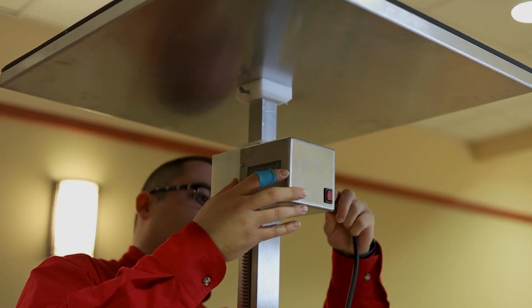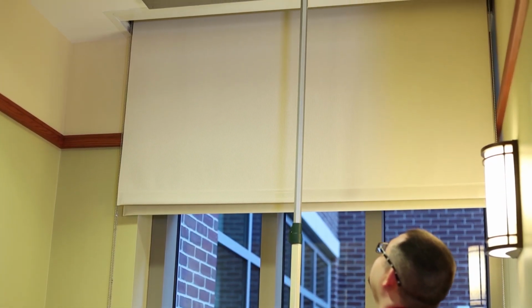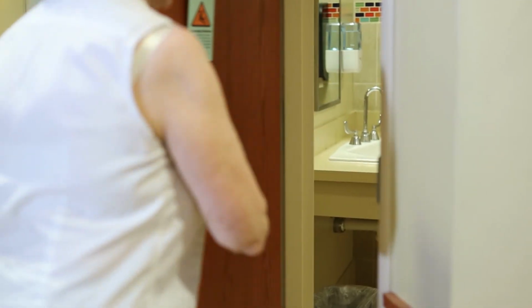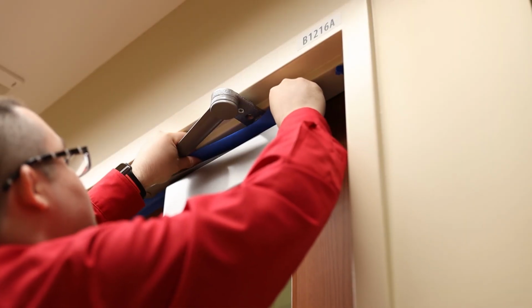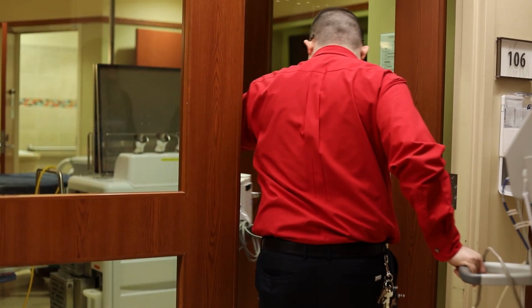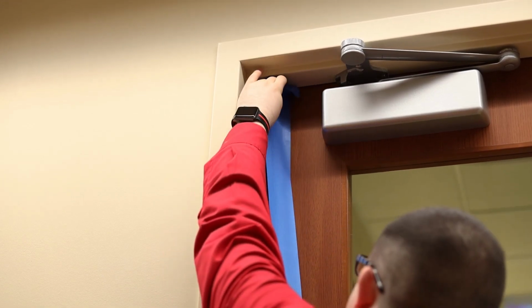During this time, you can set up the vent covers and smoke detectors. When setting up the vent covers, be sure to tighten the fasteners completely, righty-tighty. Make sure the bathroom door, cabinets, and drawers are open. Tape over any odd openings and bring in any equipment desired to be disinfected, such as wheelchairs or monitoring equipment. Then exit the room and close and tape the door.